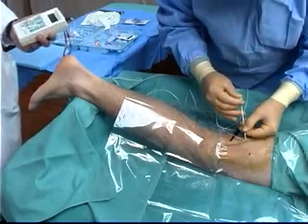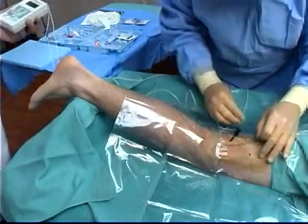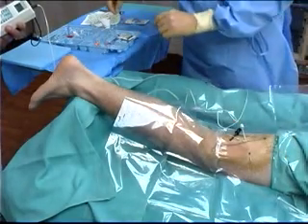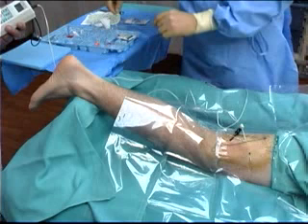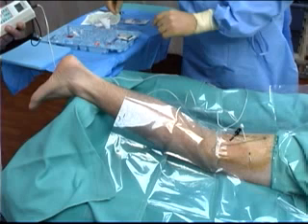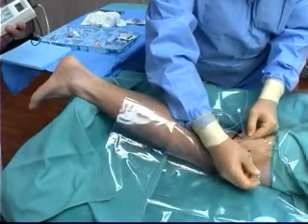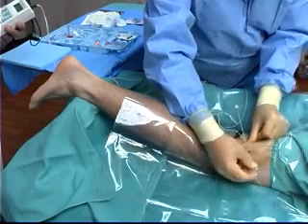Tunneling can be with a special tunneling device or by using the available equipment. First, insert the inner stylet of the needle subcutaneously from a point 1 to 2 millimeters from the catheter exit site, if a skin bridge is required, to a point approximately 6 to 10 centimeters lateral. This area has been anesthetized previously. The skin bridge will make removal of the catheter easier, but a higher frequency of catheter leakage can be expected. The needle is railroaded over the stylet. The stylet is removed and the catheter is fed retrogradely through the needle.